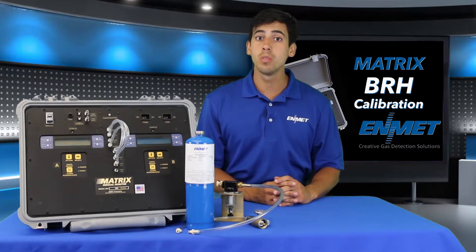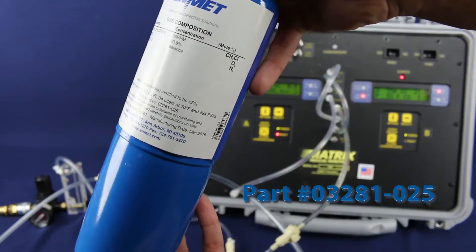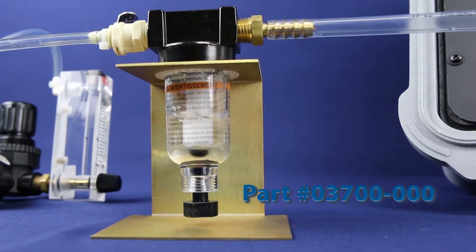Before you start you will need the following calibration equipment: 25 ppm methyl chloride which is the correlation gas used for calibration, a bubbler assembly, and a regulator.